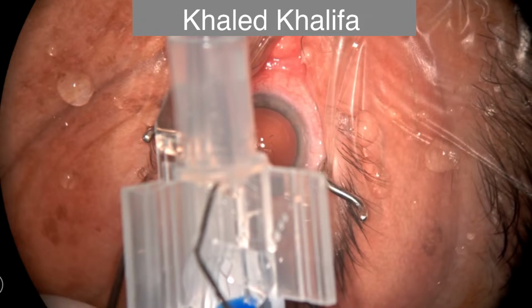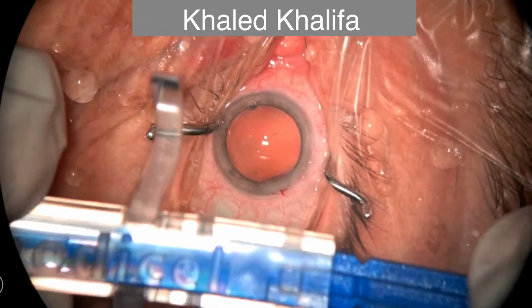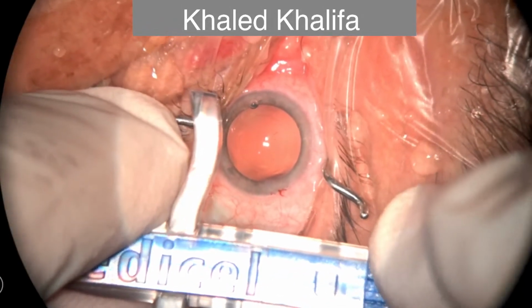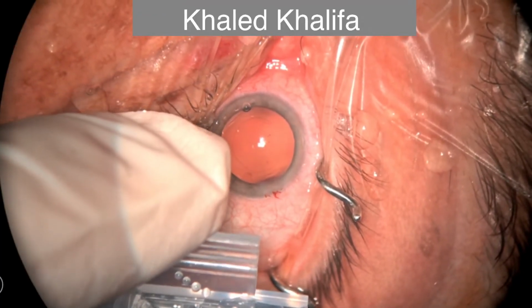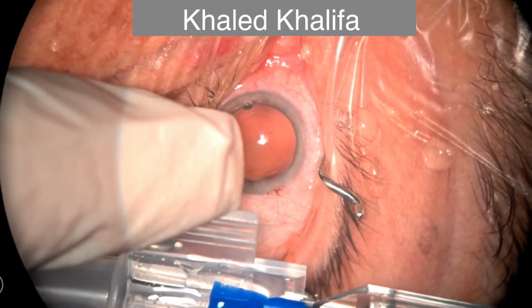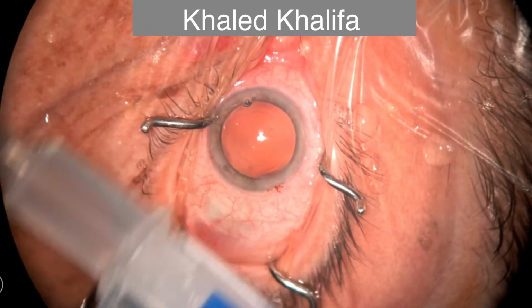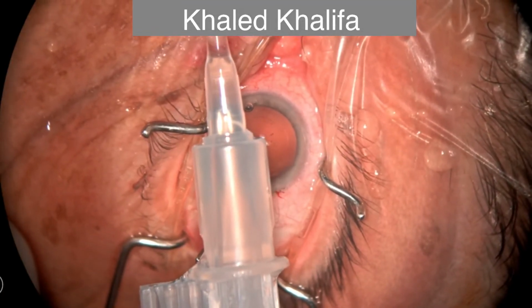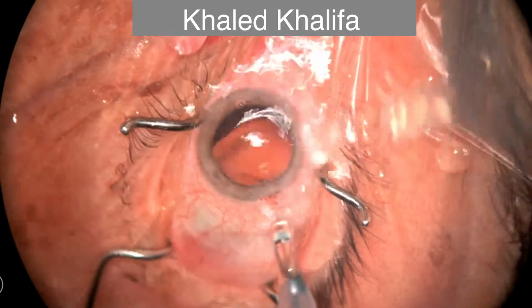Now injecting a cohesive OVD into the cartridge, then proceeding the injector a little bit anterior to this position, making sure that it pushed the IOL haptic to the desired position, then closure of the cartridge, then pushing the cartridge, checking the IOL is moving. Yes, the IOL is moving properly.